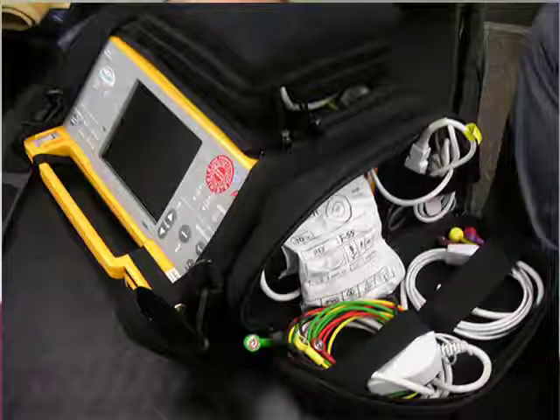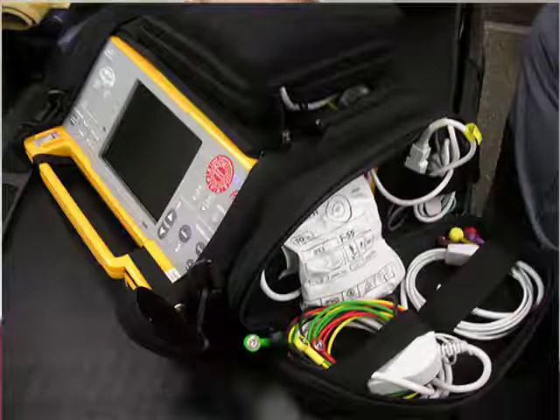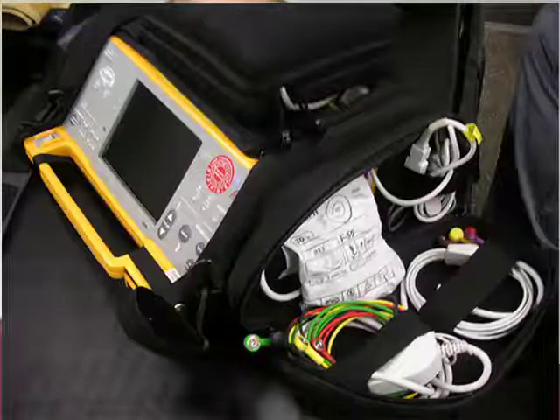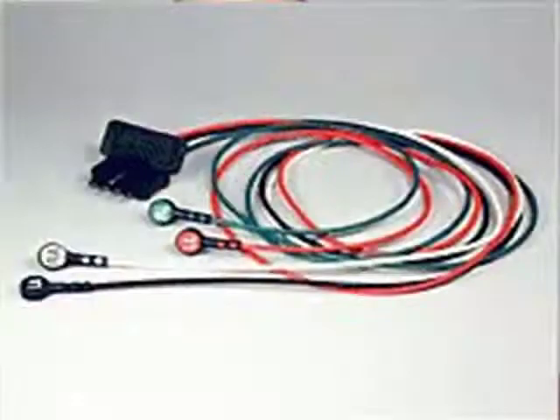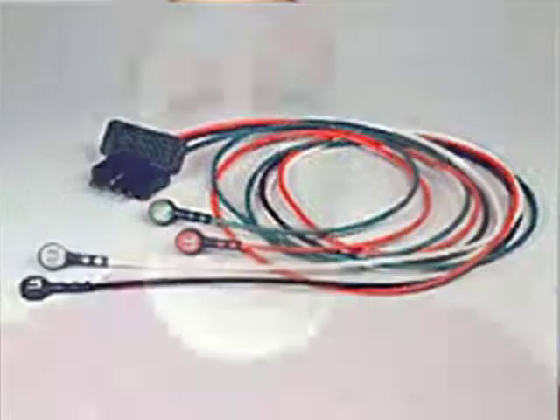Number one are the EKG leads themselves. A lot of people will take those EKG leads, roll them up in a tight little ball, and stick them into the monitor carrying case. Over time, that actually pinches the EKG wires inside the casing — something we often don't even see happening. When putting them away, try a loose figure-eight configuration in your carrier case to avoid any pinching. Pay attention especially to the connecting ends.